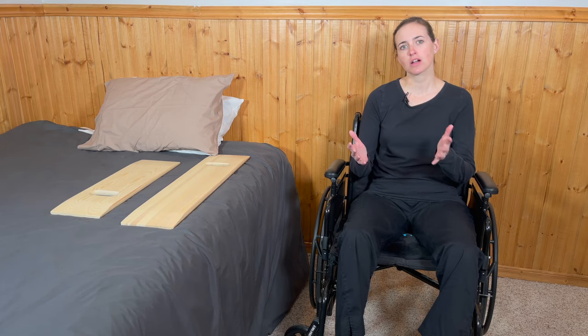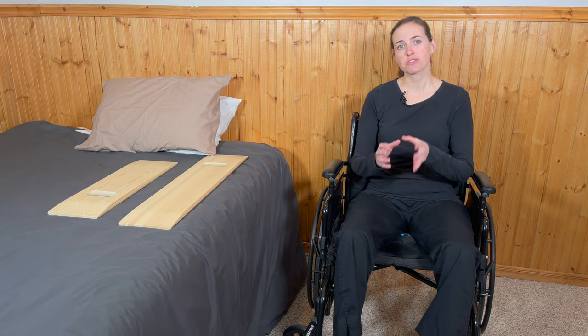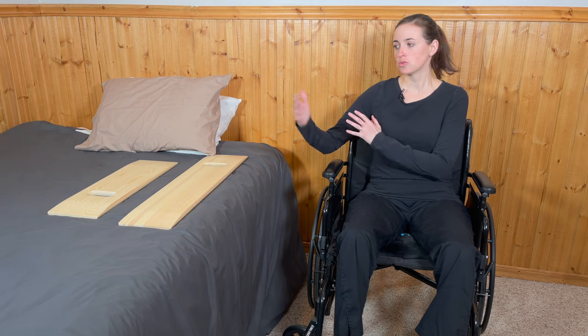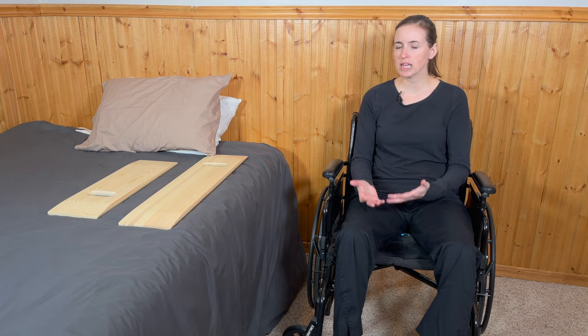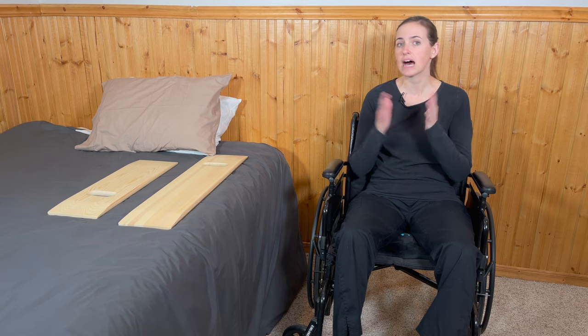Hi everyone, it's me, Lindsay, again with EquipMeOT here today to talk about a slideboard transfer. Specifically today I'm going to be going over the slideboard transfer that consists of going from the wheelchair to a bed and then back to the wheelchair again. This is the beginning of a slideboard series where I'm going to go over how to do slideboard transfers in a lot of different situations.